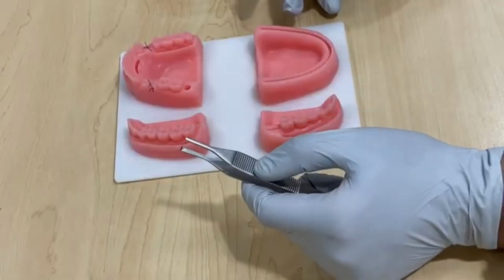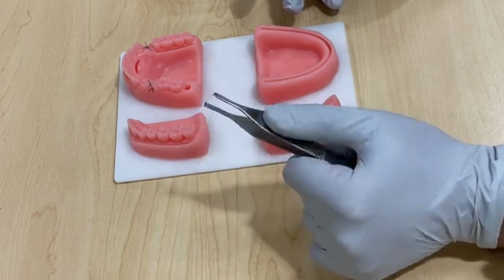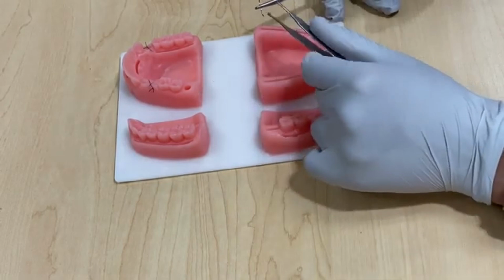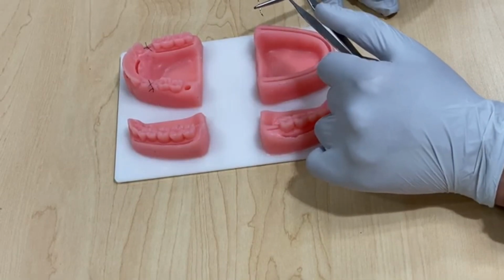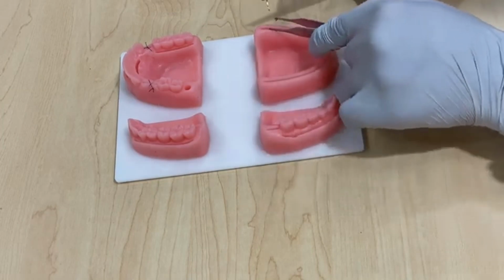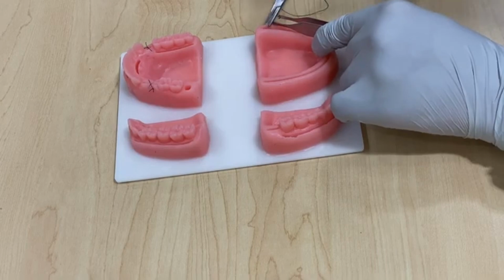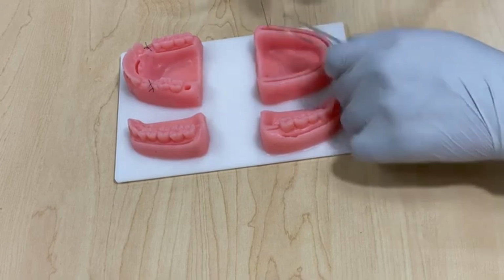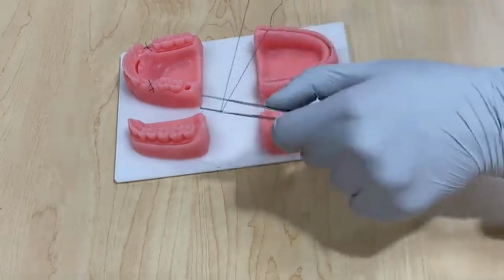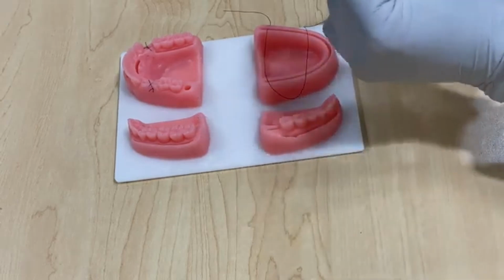Guys, so lastly we're gonna do continuous non-interlocking suture. This suture is very useful if you have large flaps, and it's very quick and easy. In future videos I may do continuous interlocking and horizontal mattress and vertical mattress. Alright, so you want to start with your simple interrupted suture. Very easy, we've done it before, right? And then you'll hold it like that, do this trick, get it all the way. You have your short tail, don't lose it.